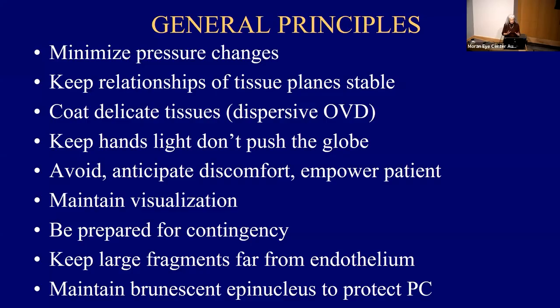Surgery, minimizing pressure in the eye is so important. Keeping the relationship of tissue planes stable, I think, is important. I was never happy about techniques that make you remove the nucleus from its space. I think when everything remains in its normal place, the eyes are quieter and happier.